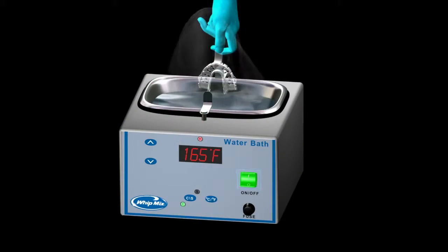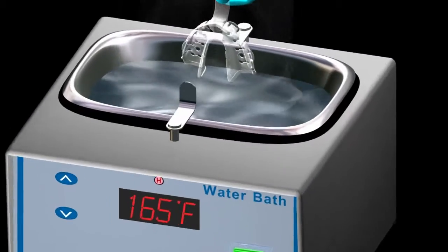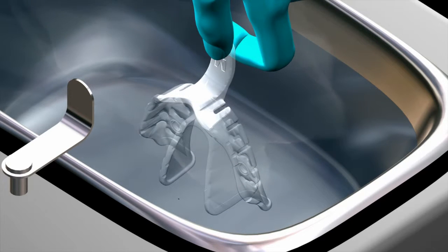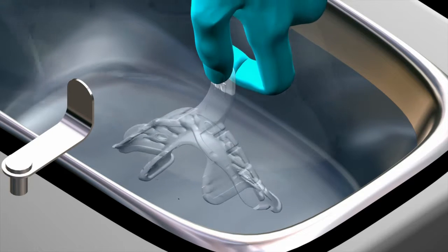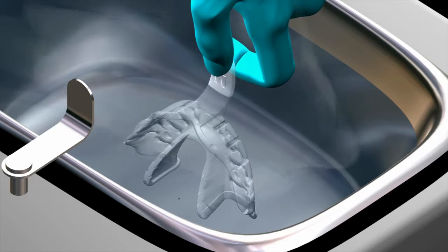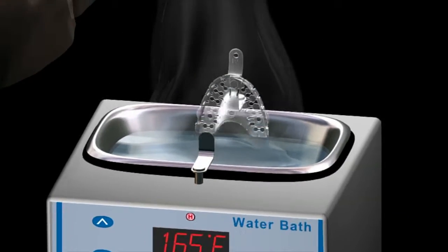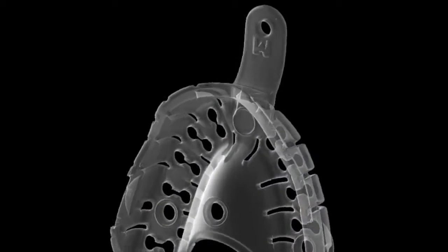The smaller trays will require less heating time compared to the larger trays. Only the body of the tray should be completely immersed in the hot water bath, held by the handle slightly outside the heated water. The tray can be manipulated to ensure adequate flexibility has been achieved. Also, when removing the tray from the water bath, avoid shaking the water off, as this will accelerate the hardening process before placement in the mouth.